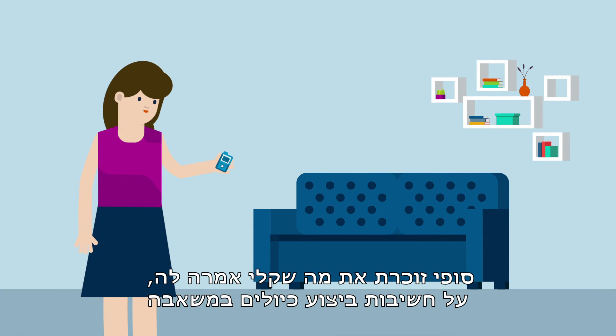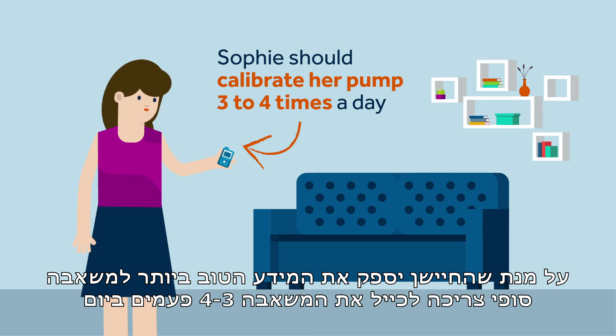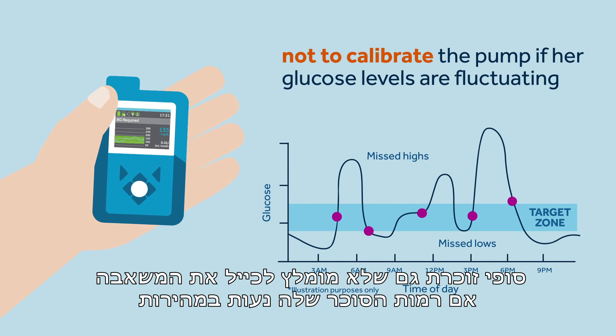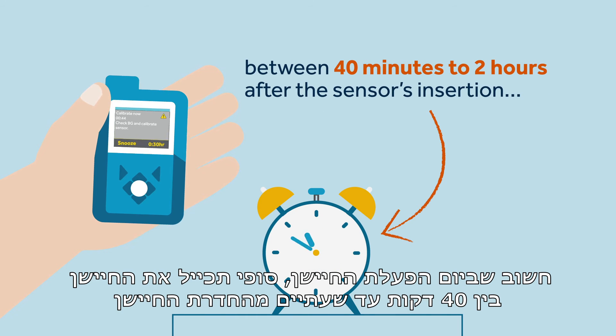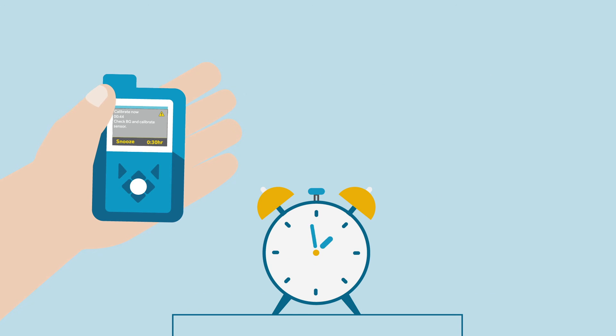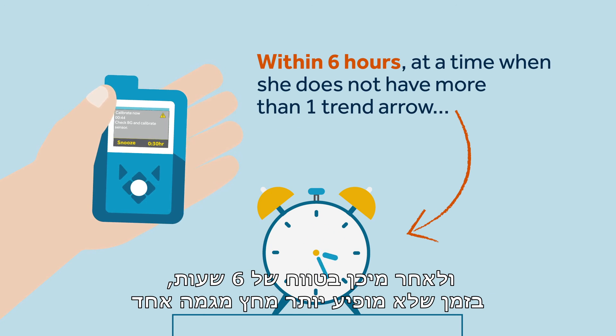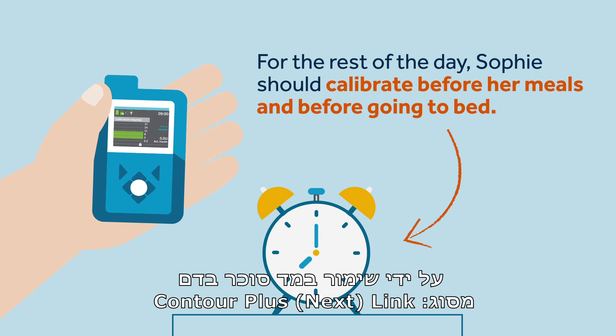Sophie remembers what Kelly told her about the importance of calibrating the pump. For the sensor to provide the pump with the best information, Sophie should calibrate her pump three to four times a day. Sophie also remembers it's important not to calibrate the pump if her glucose levels are fluctuating. On the day of the sensor's startup, Sophie should calibrate between 40 minutes to two hours after the sensor's insertion, within the first six hours at a time when she does not have more than one trend arrow. For the rest of the day, Sophie should calibrate before her meals and before going to bed.